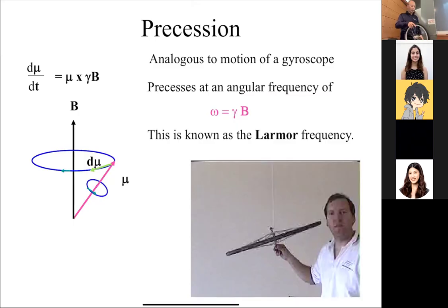But, and probably you've seen this, I can give it angular momentum. And so here, if I give it angular momentum, it's going to precess around. So this is exactly what the spin does, and you can imagine the magnetization precessing in this way. That's what these equations of motion are saying: the spin acts exactly like this bike wheel does. So that's something you can keep in mind, and a fun experiment.